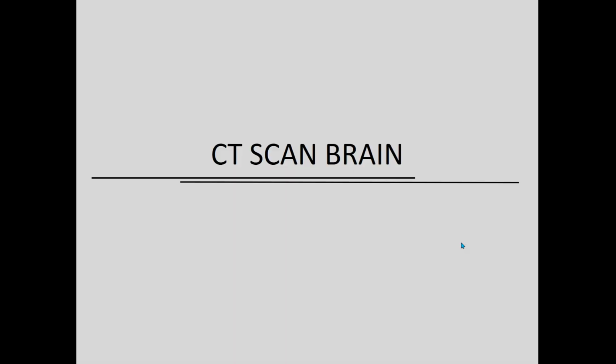Now what about the CT scan brain? CT scan brain is included in your syllabus. That is basically CT scan brain for trauma. And you know that for trauma we use a plain CT scan, that is without any contrast.